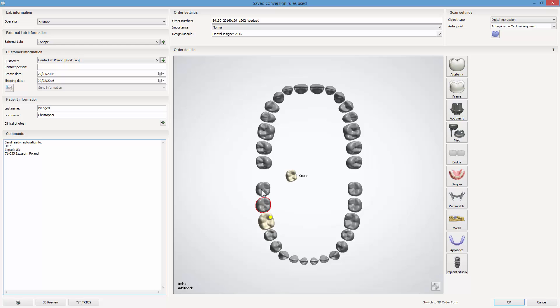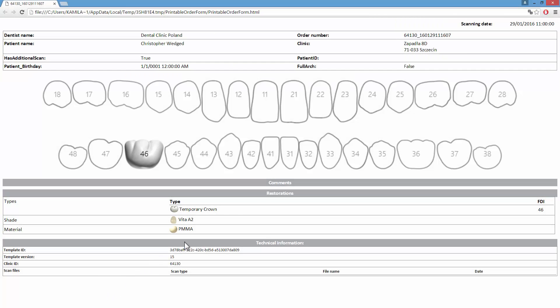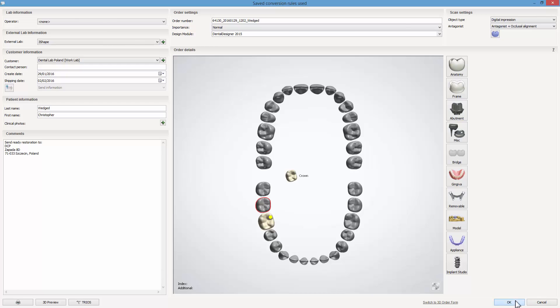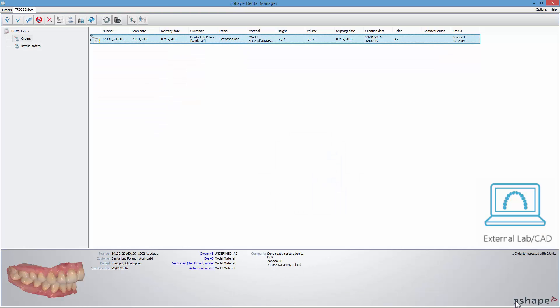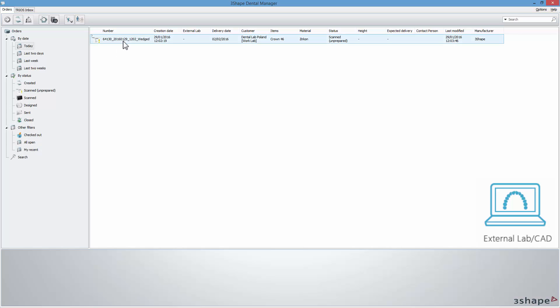If you are going to send a produced restoration to the dentist, you can find contact information through the order form by clicking the TRIOS button or check the Comments field. The imported order will now move to the Dental Manager. Proceed with the design as you usually do. After finishing, save the case.